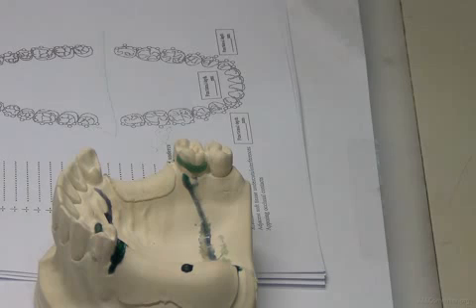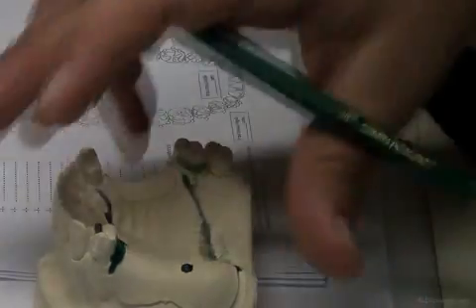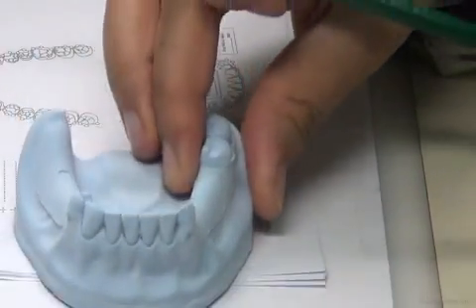What else should I do before I begin my design? Information that will alter my design, and I have to have taken it. I take some information from the survey. What else? What about clinical examination? Occlusal examination. Because the clinical examination will show me things that I could not see on a solid cast. The cast is solid.